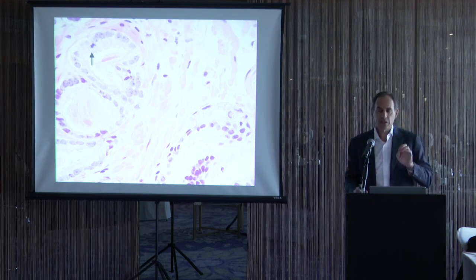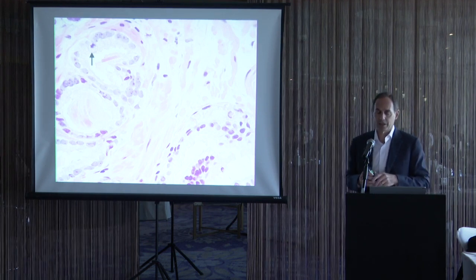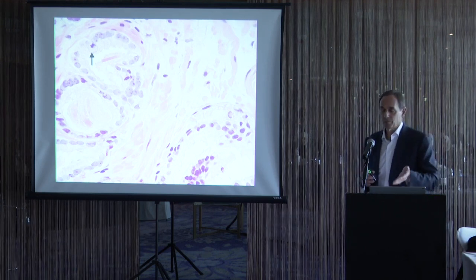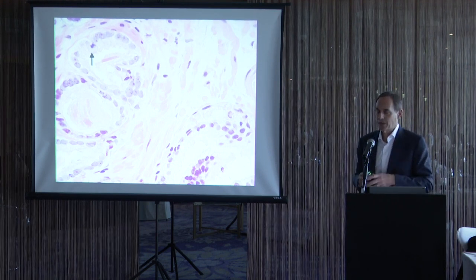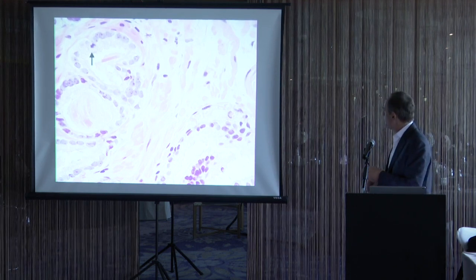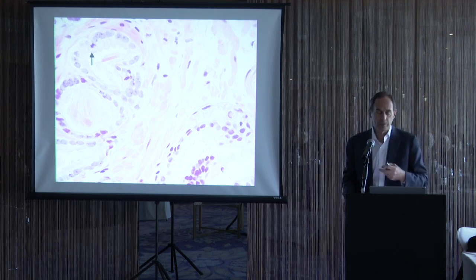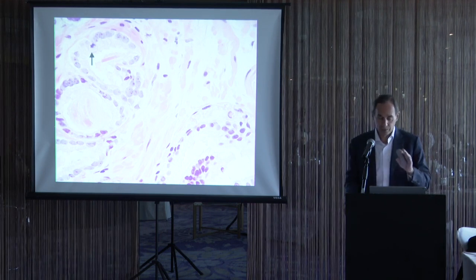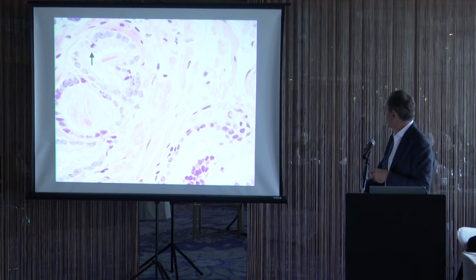So it is not common to find mitotic figures in lower grade prostate cancers, the ones that you're struggling to diagnose. However, if you find a mitotic figure, it favors prostate cancer. Again, it's not specific for prostate cancer. Atrophy, as I'll talk about, can have mitotic figures. High-grade prostatic intraepithelial neoplasia can have mitotic figures. We also see this geometrical shaped eosinophilic structure, which is a prostatic crystalloid. More common in cancer than benign, but you can see them in benign glands as well. So again, it's just one feature by itself, not specific, but favors the diagnosis of cancer.